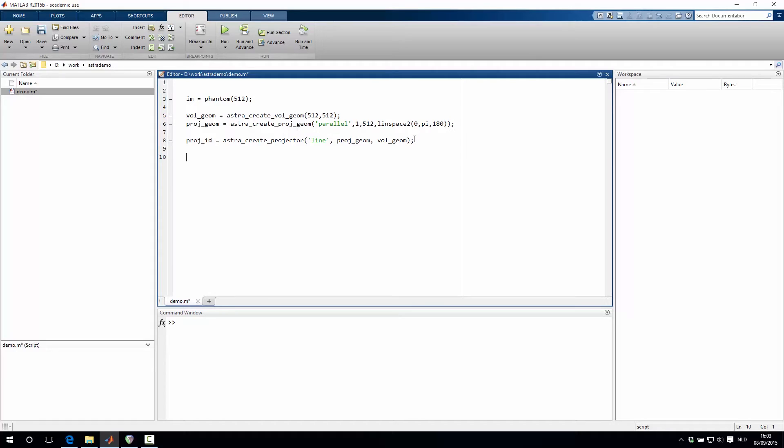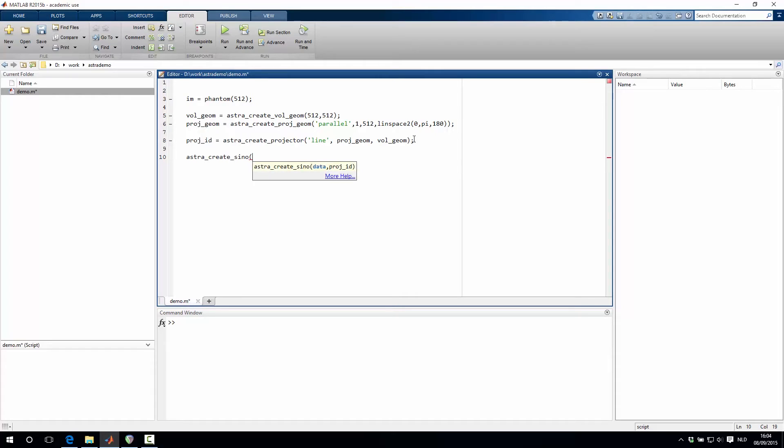So the next step is to create the sinogram, or to simulate the sinogram. This is done with the astra_create_sino function, where we specify which image that we want to project. In our case, it's this image here.